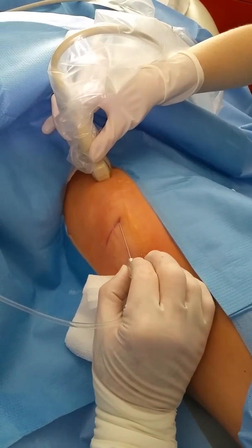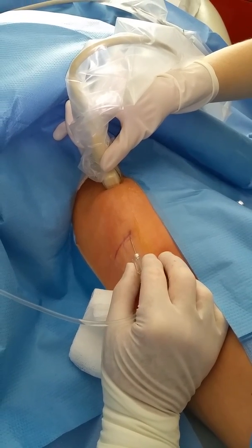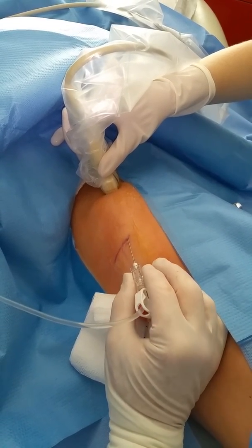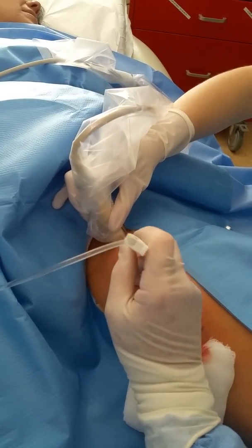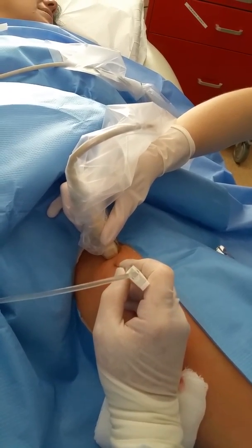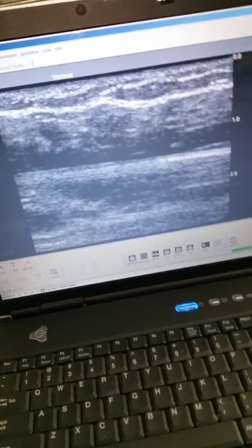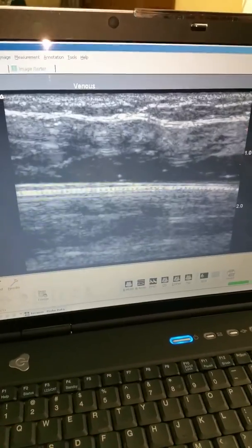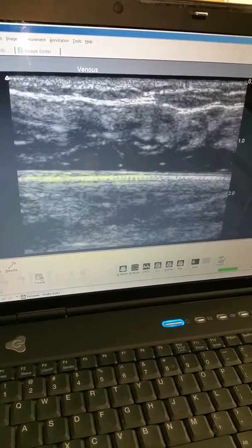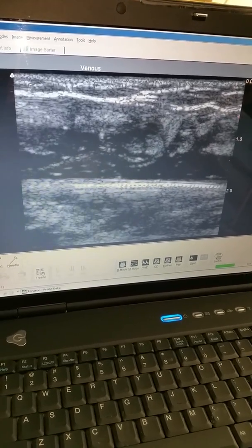I also come across and put a little tumescence on the skin so the patient doesn't feel the second stick. You can see there's a nice even water sheath going down there. We're going to get it down below two centimeters — you can see it being driven down.